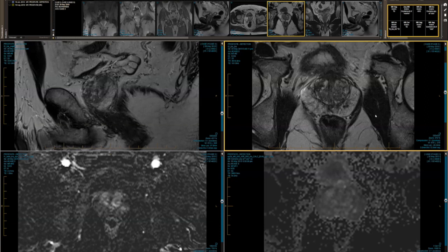And the other thing is there is some clinical data. We've got some clinical data from our active surveillance cohort. And when you look at how the patients with visible 3+4 do compared to those with non-visible 3+4, actually those with non-visible 3+4 fare similarly to the 3+3s. Yeah. You can see that in the paper in European Urology, Stavrinides, a nice Kaplan-Meier which shows that really clearly.